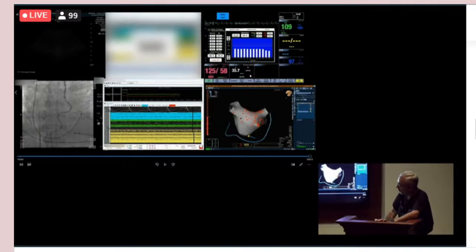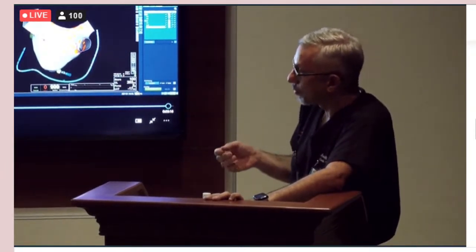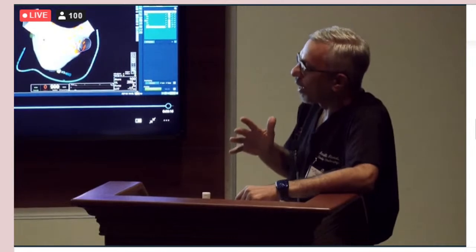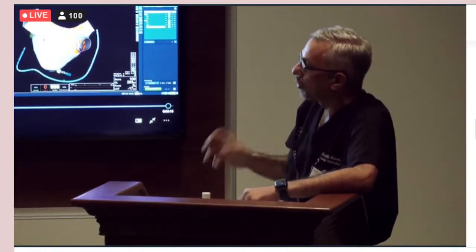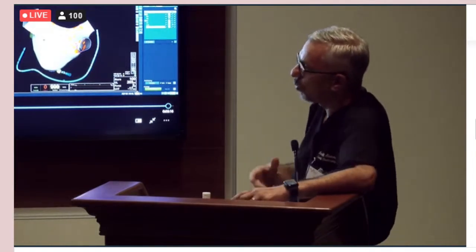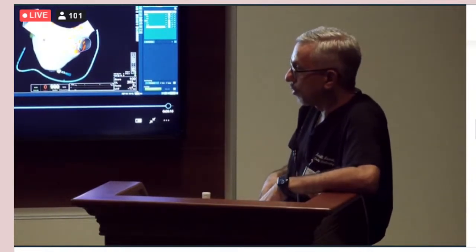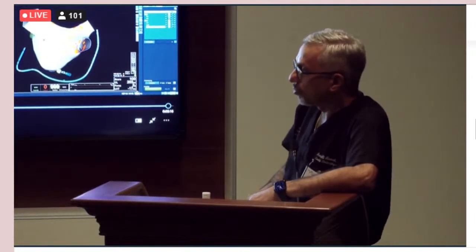And for power settings on the posterior wall and the anterior wall, do you use just straight power and time, or do you use FTI or something else? Yeah, straight power and time. What we've gotten used to doing is ablating at about 40 plus watts in the posterior wall, but modulating time. If you go back and look at the cases and how much time is spent on a lesion, you'll find that the average is about 5 to 7 seconds posteriorly, 7 to 10 seconds more anteriorly in safer spots. You can definitely get away with ablating posteriorly more if you know you're far from the esophagus, and there's some ways of knowing that. Occasionally we'll inject contrast and see how big the esophagus is. There's some patients with small atria, where the esophagus is the whole posterior wall, and so in those you have to skip around a little bit and use short times.